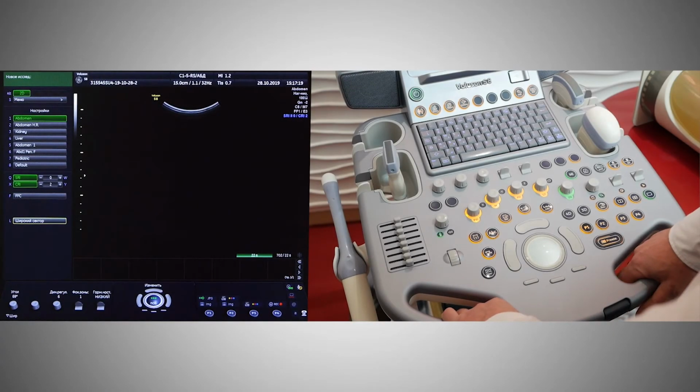Voluson S8 is designed for general clinical ultrasound examinations. It has specific features for examinations in obstetrics and gynecology as well. It supports linear, convex, 3D convex and 3D vaginal transducers. That allows for 3D examinations in obstetrics and gynecology. What does the work on Voluson S8 begin with?